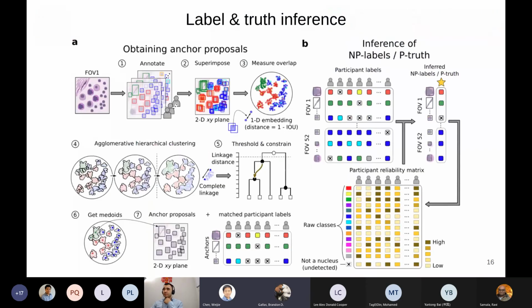Yeah, and if I could, just to make sure I understand, really the STAPLE method is your panel B, because in the STAPLE method, there's only one object being segmented, and so there's no issue with trying to cluster things and say that they're segmenting the same thing. And so panel A is trying to get down to individual objects. And then panel B still sounds a lot like the STAPLE method, but it's the STAPLE method on each one of those objects, or maybe all of them at the same time. No, you're right. It's per object.